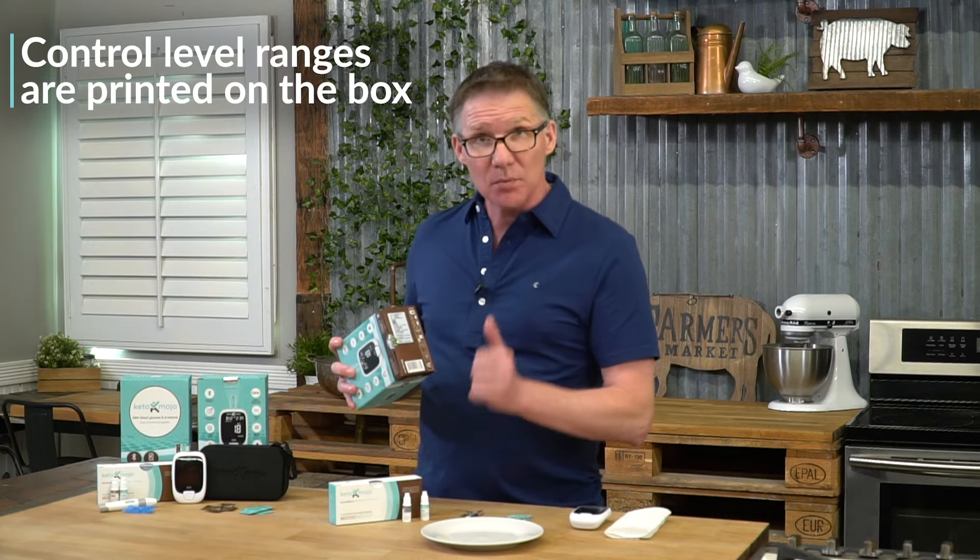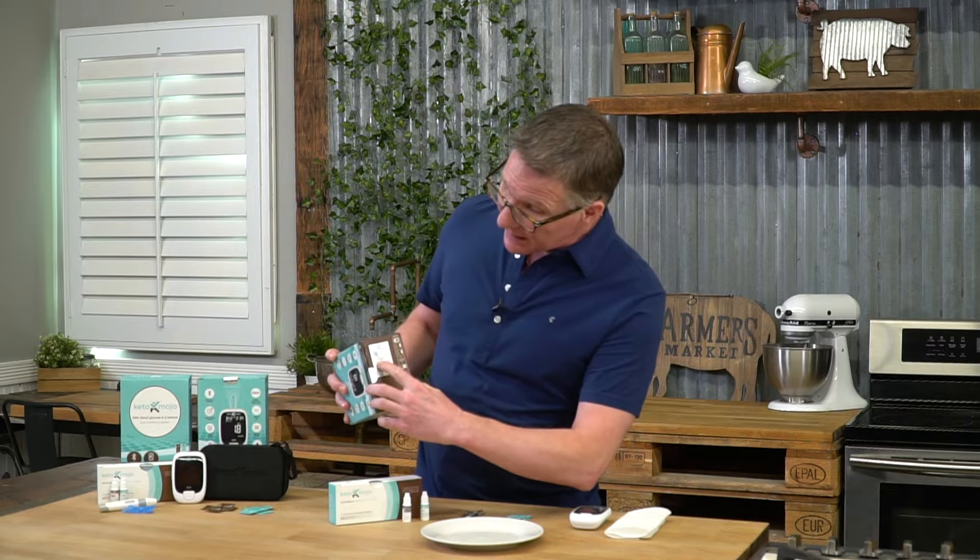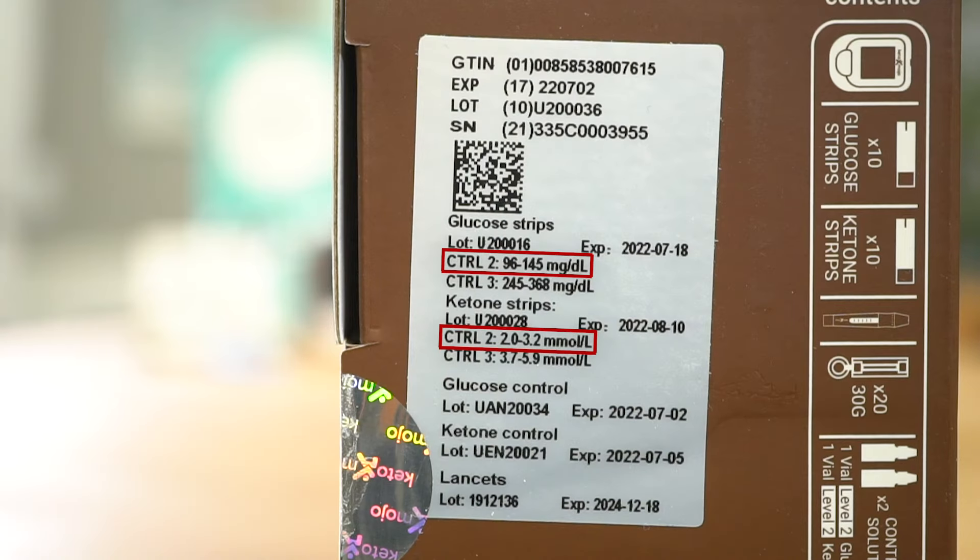Your kit comes with a level two control solution. You will look at the base here and you will see level two control. That is the range that your meter needs to perform in to make sure that you know it's working right.